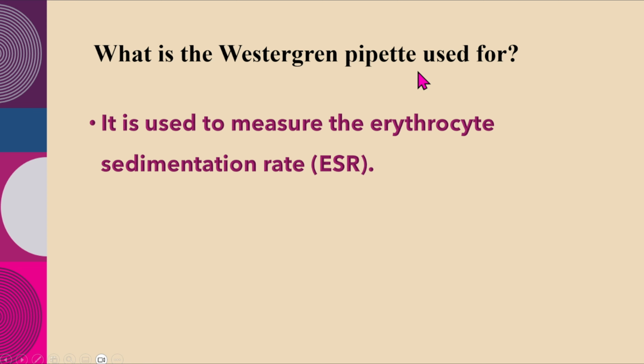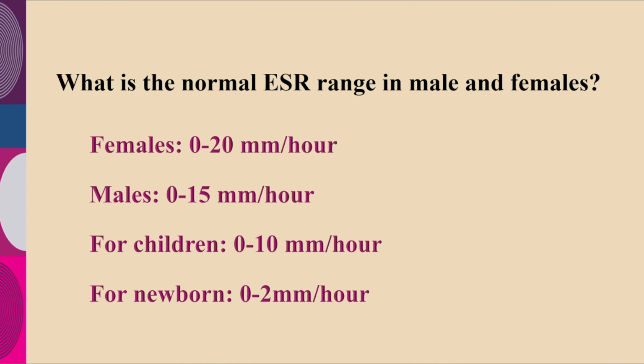What is the Westergren pipette used for? It is used to measure the erythrocyte sedimentation rate. Questions are asked by turning around the same question. So I have repeated a few questions in different ways. So you will memorize this while watching the video, inshallah.